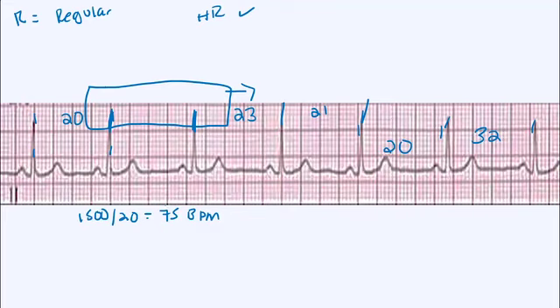In the third step, we need to look at the P to QRS ratio. Do we have one P wave followed by a QRS? And we do. Every single P wave on this strip is followed by a QRS.